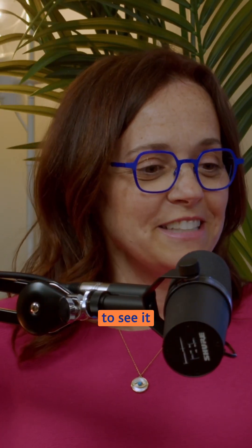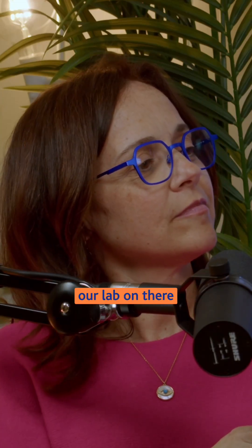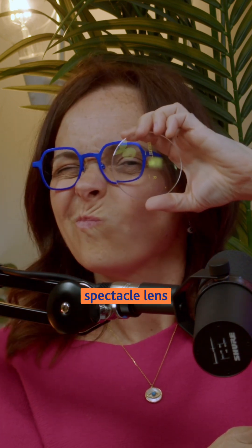I actually have a lens here if you'd like to see it. So this is the lens here, so you can have a little look. It's got some markings from our lab on there, but you might be able to see that cosmetically it will look like a normal single-vision spectacle lens, so no difference.